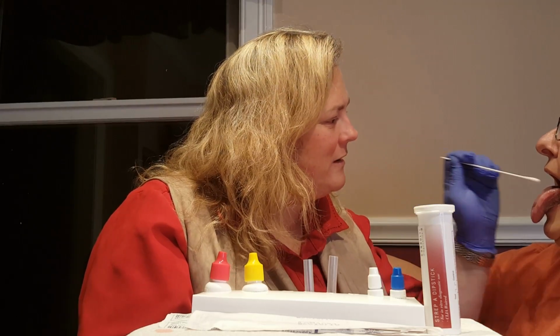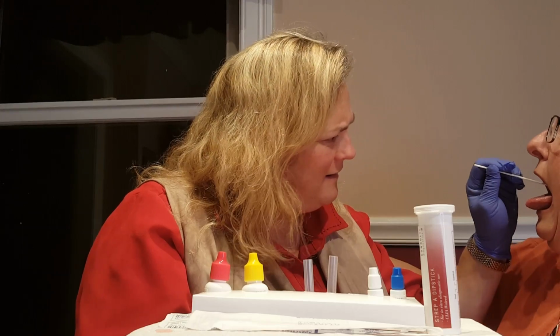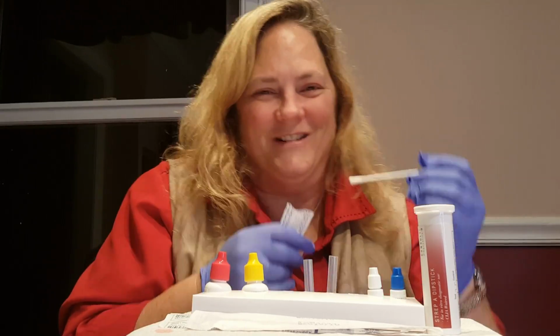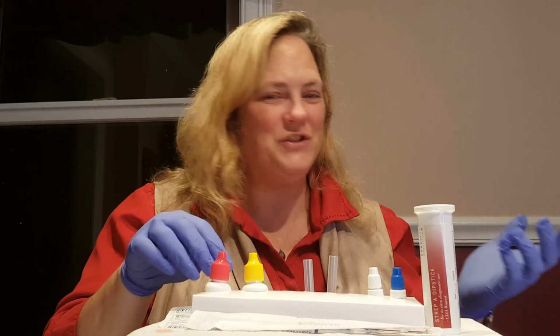Okay, please open your mouth and stick out your tongue. I'm going to insert the stick and touch both tonsils. Okay. Thank you. Okay, so I've gotten the patient's sample.